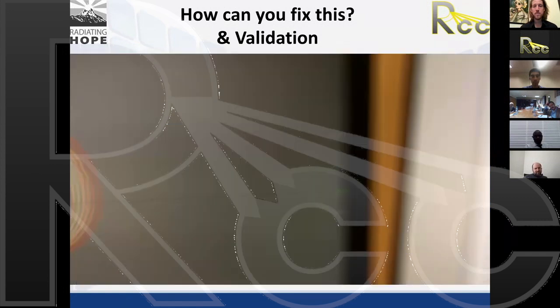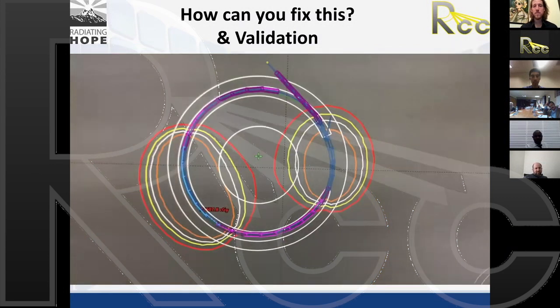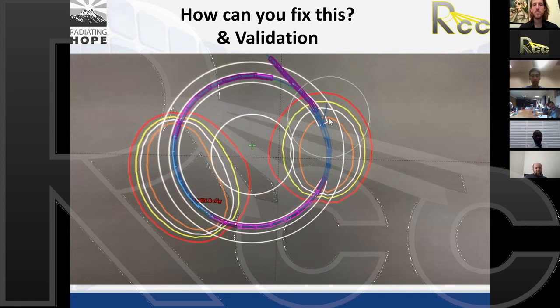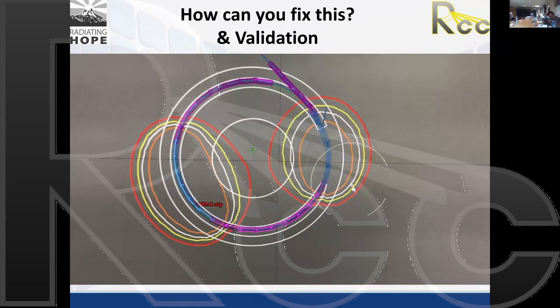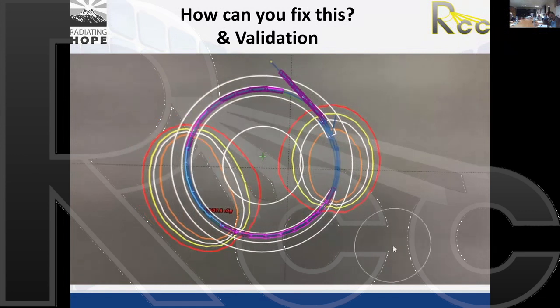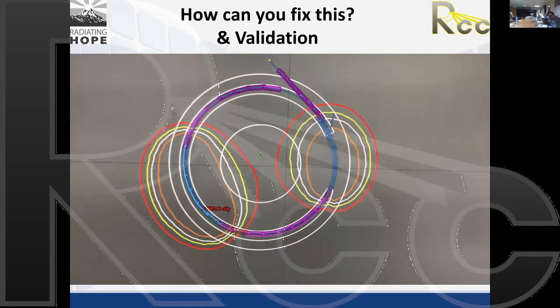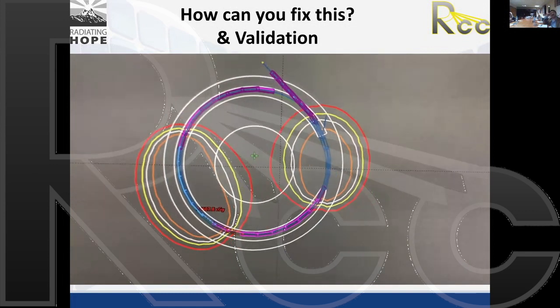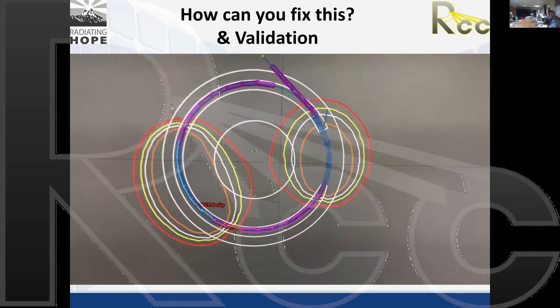So on our planning system, the isodose lines look like this. And still, our reconstruction point is at the internal edge of the inner lumen. So if this is what it looks like on our planning system, then on the actual patient when it's delivered, remember delivery is 5 millimeters closer to the tip, so delivery looks like this as we want it.